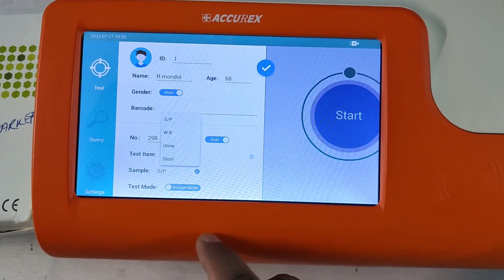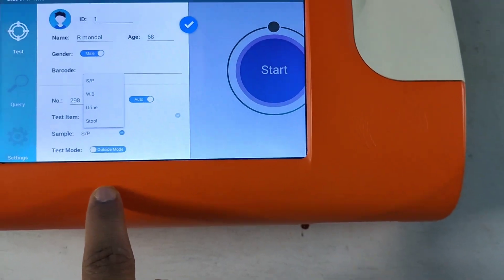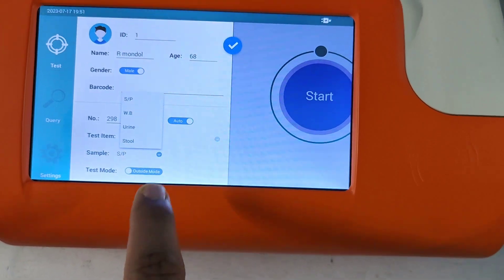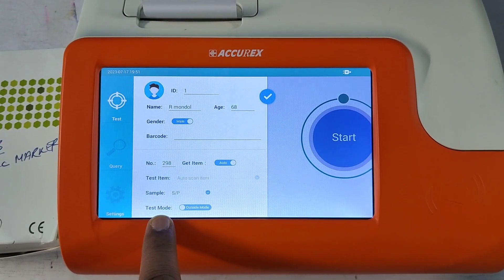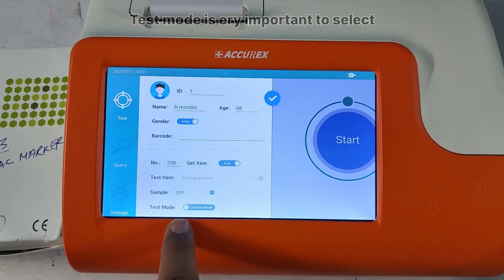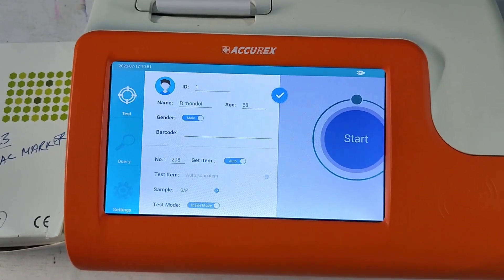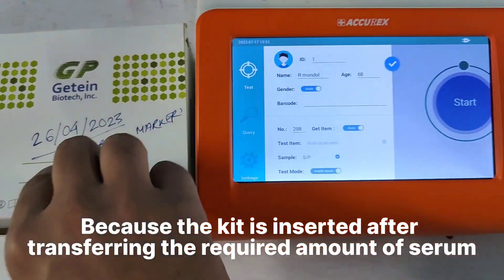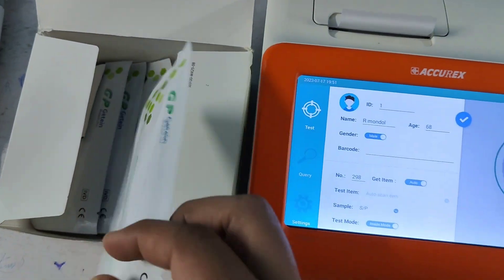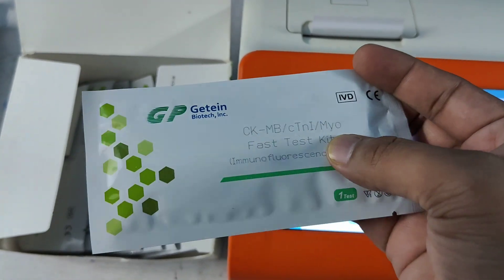For each specific test — in this case for the cardiac marker test — I am going to use serum. That's why I am going to select serum or plasma. The test mode is very important: it is currently showing outside mode, but you have to select inside mode by pressing and touching this.